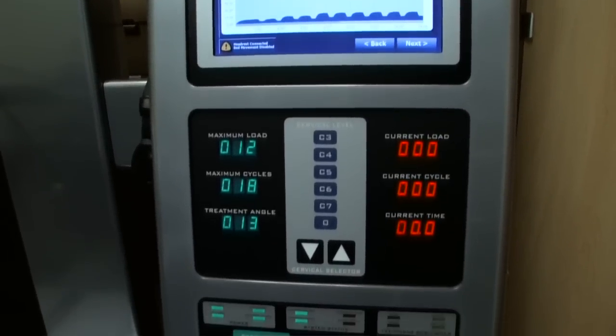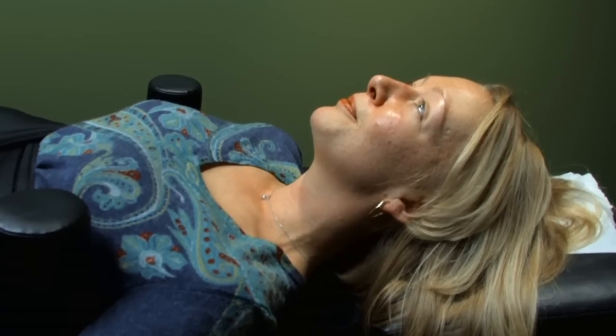People who would not be candidates for decompression would be those who have had severe spinal trauma that is unstable, or they have had recent back surgery. We do see some people who have had back surgery after 6 months may be candidates, or neck surgery after 12 months. So we have helped a number of people who have had surgery and it has not been successful. So this does offer hope. Those tend to be more complicated cases, but again, we rule that in or rule that out on the initial visit consultation. Some elderly patients we can help, particularly, I would like to say regardless of age, degenerative lower back problems and neck problems, we can often help them.